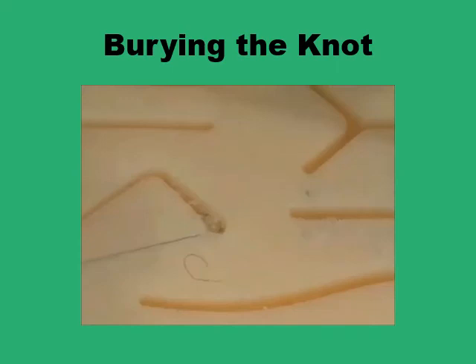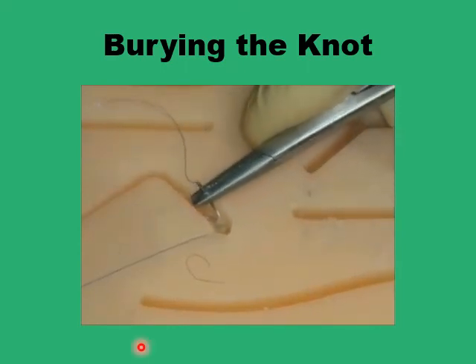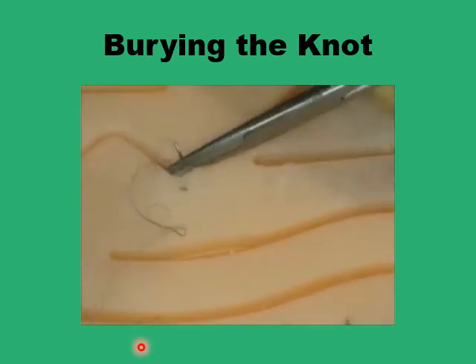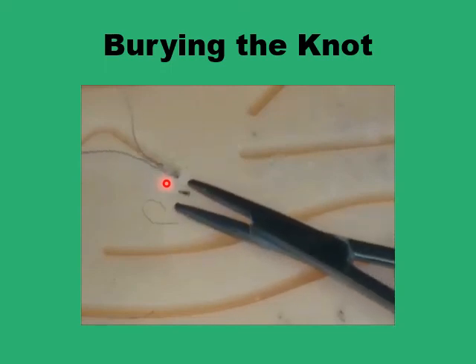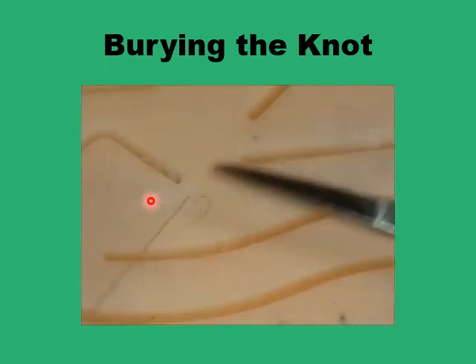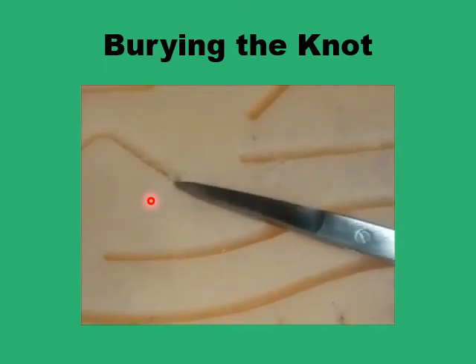What you want to do next is to bury the knot in the subcutaneous tissue and retrieve the suture line to the surface. To do this, you just pass your needle under the knot in the subcutaneous plane, bring it up to the surface beyond the apex of the wound, and pull on the suture. This will bury the knot, and you just cut the suture flush with the surface.